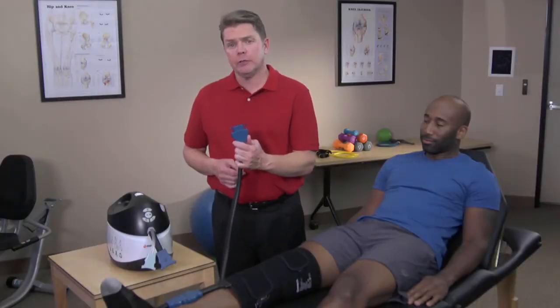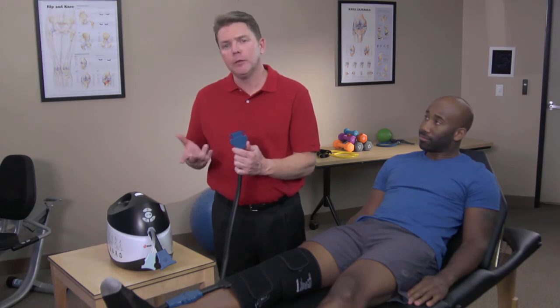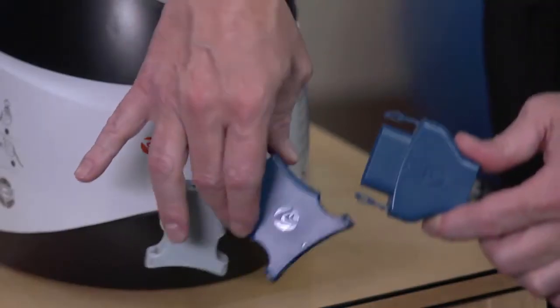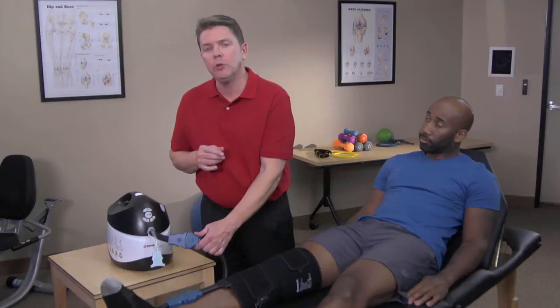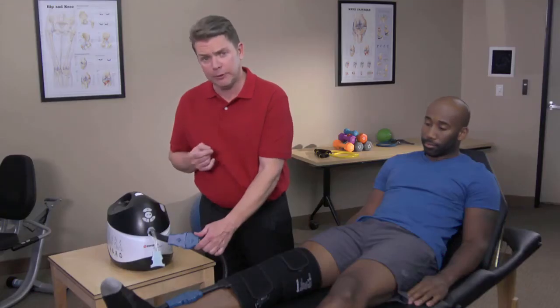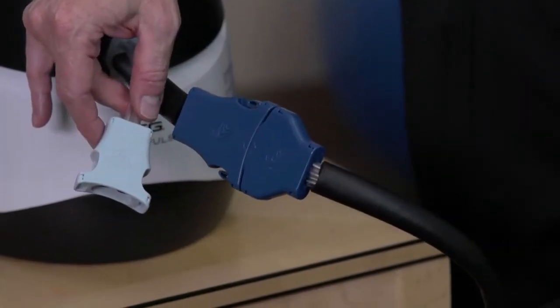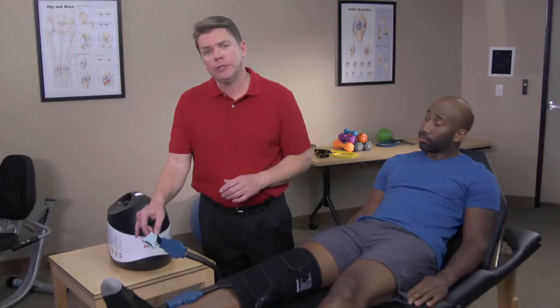Attach the dark blue connector attached to your thermal pad to the dark blue connector on the V-Pulse container. This connection can only be made one way and you will hear a click sound when fastened properly. You can ignore the light blue connector attached to the V-Pulse container. It's for an additional therapy option that your doctor has not prescribed.